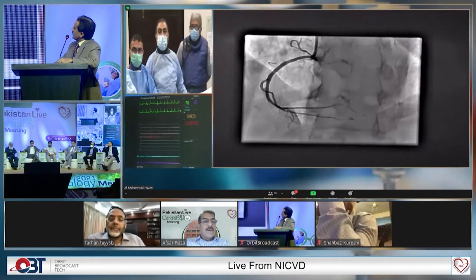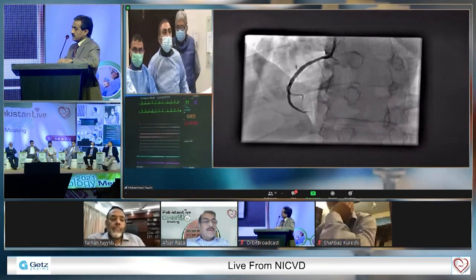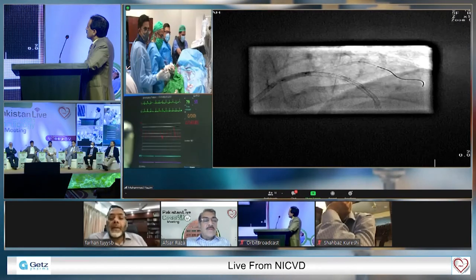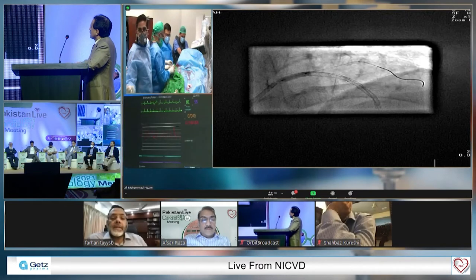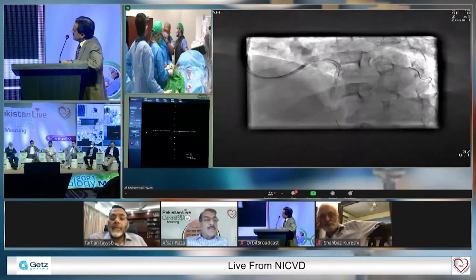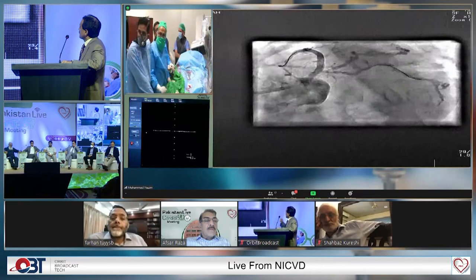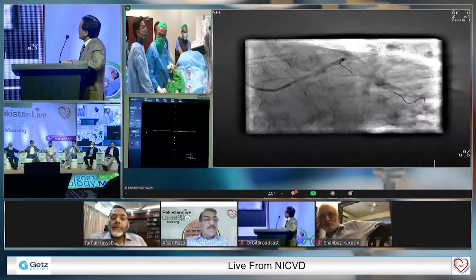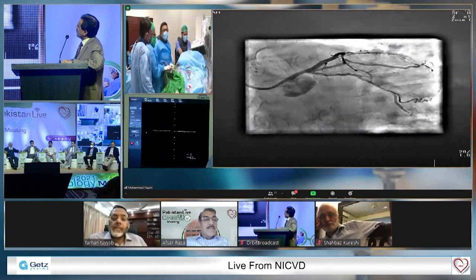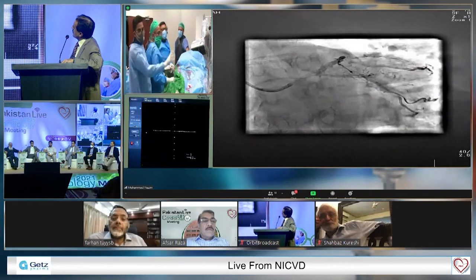Okay, do you want to move to the other lab quickly? Show us the last picture, because the time is over and we have to move on to the cases. We are back to you. Please tell us what has happened since we left. Just keep showing us the pictures. So they post-dilated. Picture in the spider view. After being caught, as you have seen, we took a third wire and recrossed it.